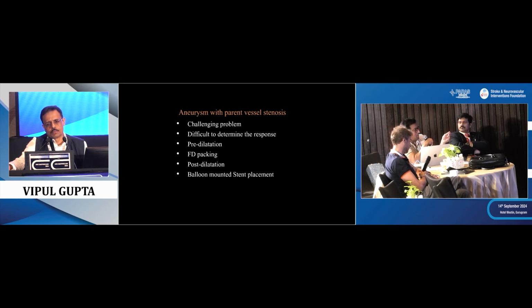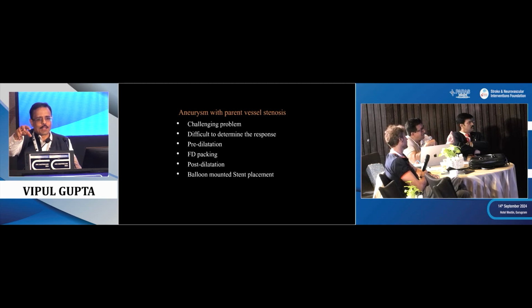I learned something here. What you are showing me is you had pre-dilated it, which is amazing, because I wouldn't have done it. Okay, that's very interesting. So, we use a neuroballoon. Now, the question is, would anybody pre-dilate with a coronary balloon?